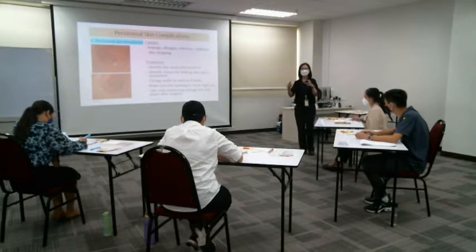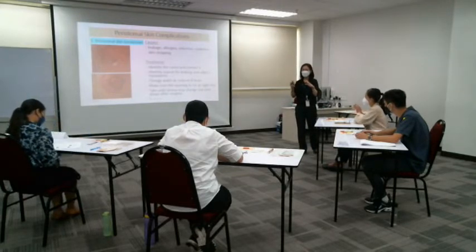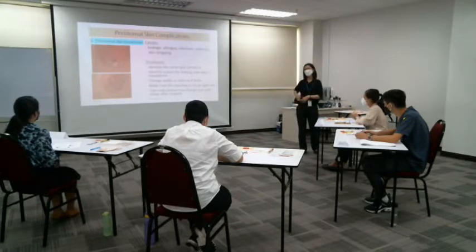So initially it may be bigger, later on it will shrink. So if you continue to cut the same shape or the same size all the time, then it can be too big. So sometimes it has to be minimized.